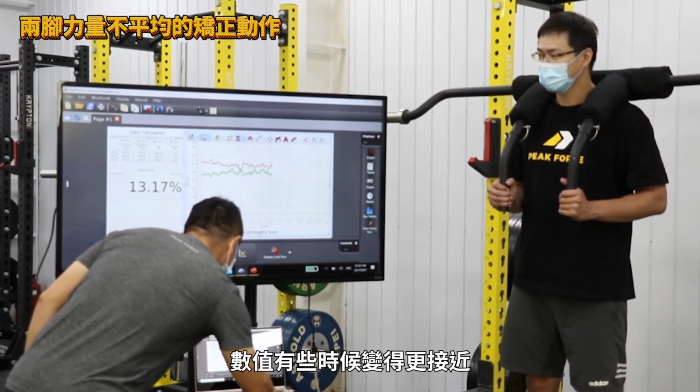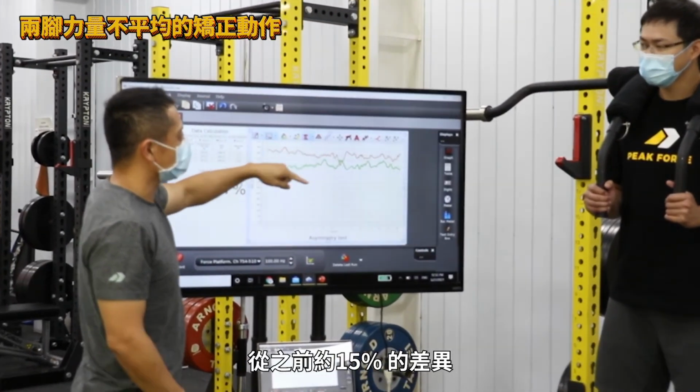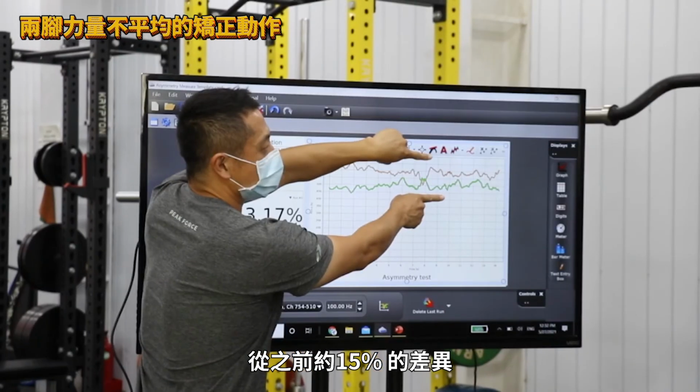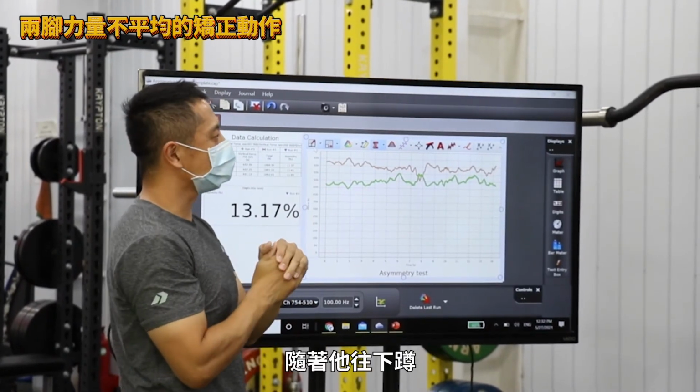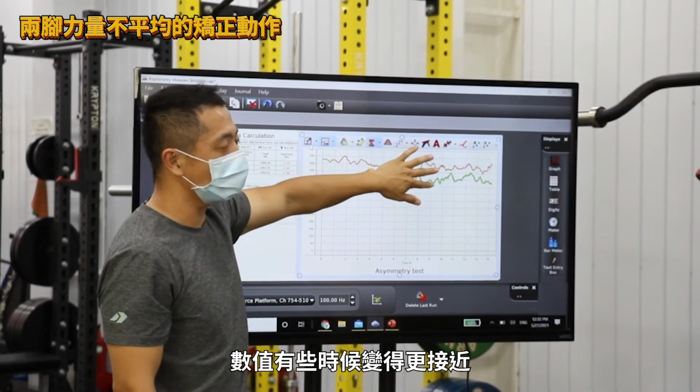So now, actually, you can see here. I'm gonna zoom in a little bit closer. The value here, before it was about the 15% difference on the graph. And then as he squats down, you can see sometimes the value gets closer and closer.